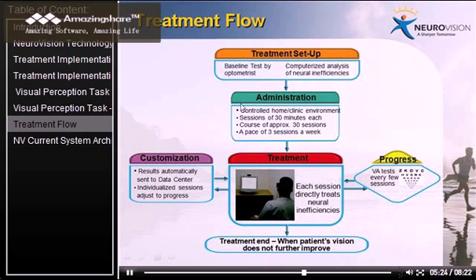It can be less for some products, it can be some more for others, but on average I can say it's approximately 30 treatment sessions. Each session lasts about 30 minutes, and they should do approximately 3 sessions a week. That can be done, as I said before, at home or at the clinic.